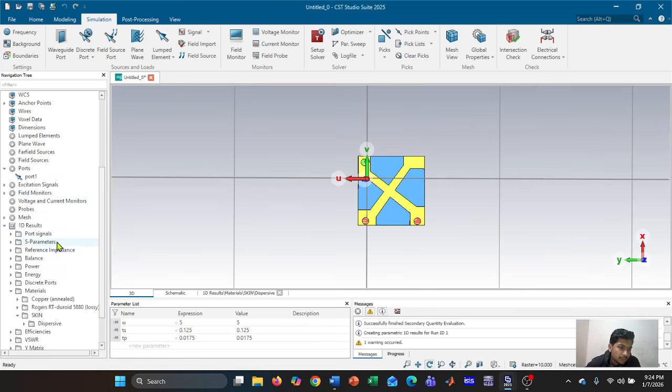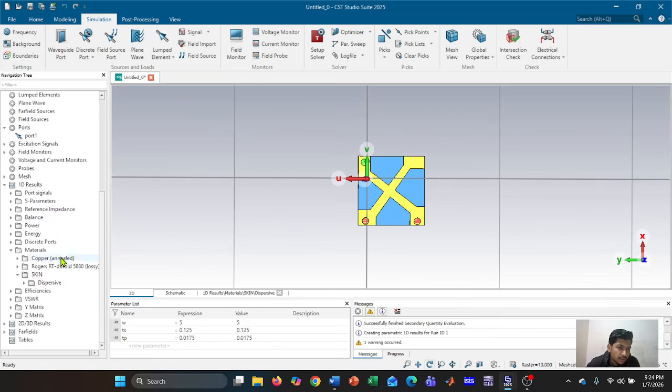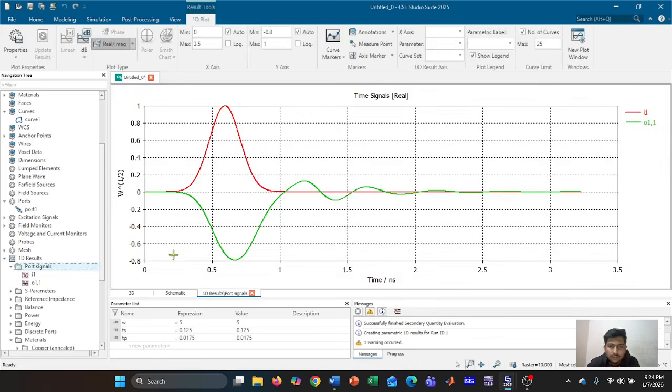1D results. You can see the port signal, S parameter, reference impedance, balance, power, energy, discrete ports, efficiencies. Also we have 2D results. So first of all, let's see the port signal results. You can see here the red ones, port signal, shows the input and reflected signal.